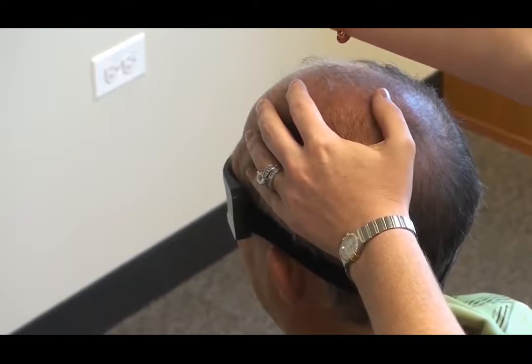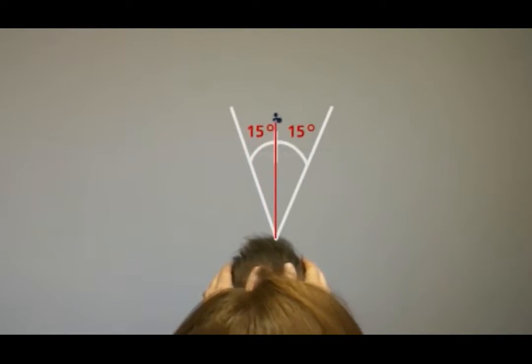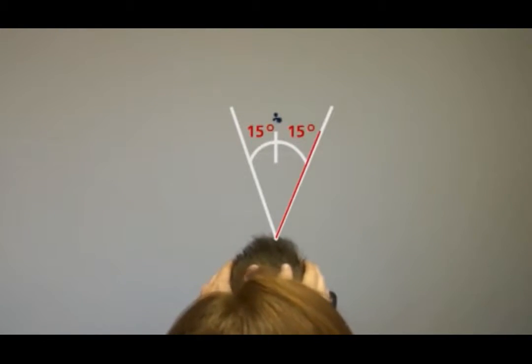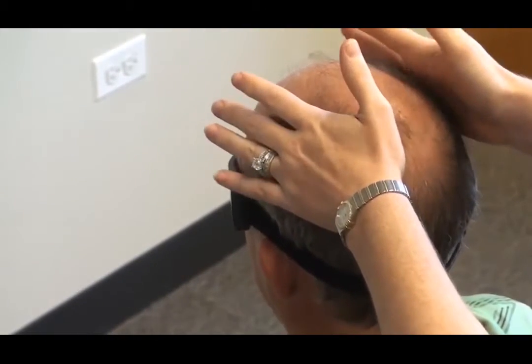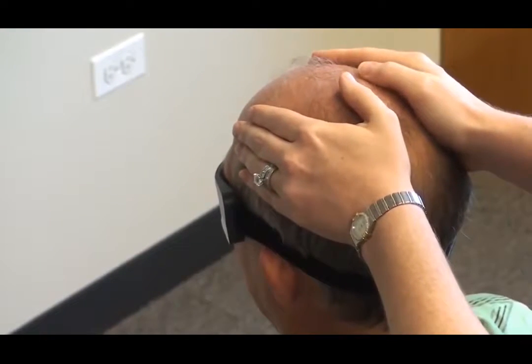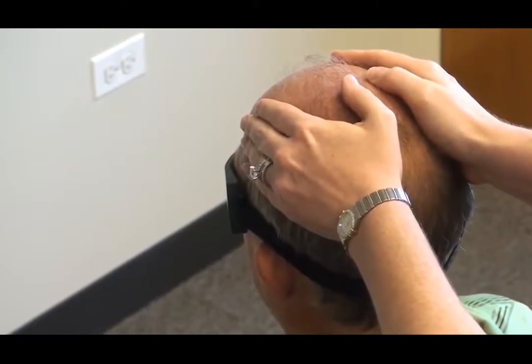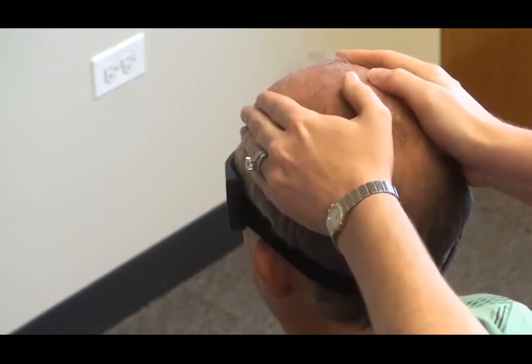You don't have to move the head very much, only from 10 to 20 degrees, but you want to make it quick, 150 to 200 degrees per second. If you think about it, it's like rolling a pencil in your hand. You will push with one hand and pull with the other hand. So when you do a head impulse, hold on firm and quickly move the head. Hold it there and then move the head back to center. It is a quick, abrupt motion.